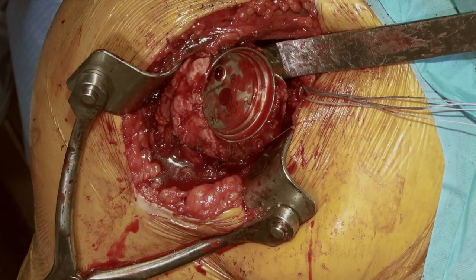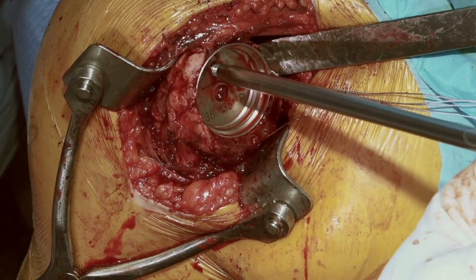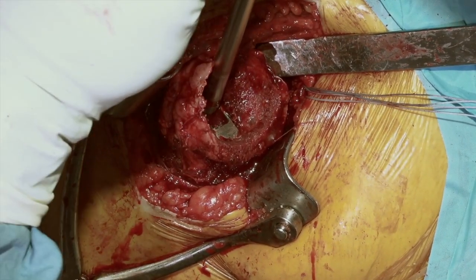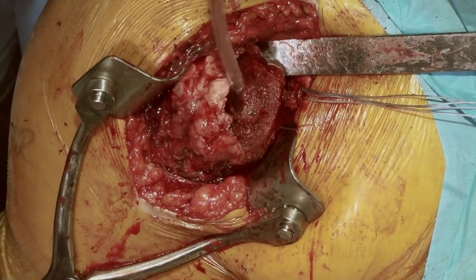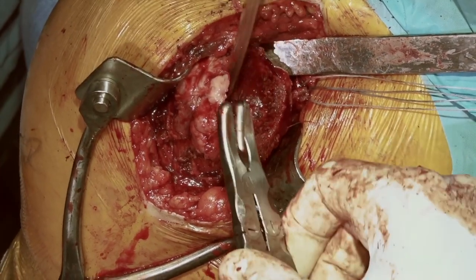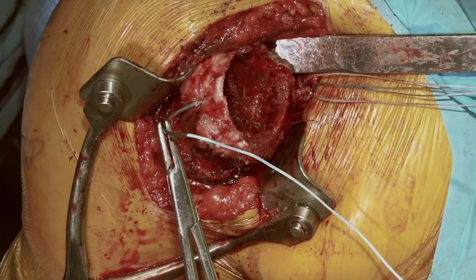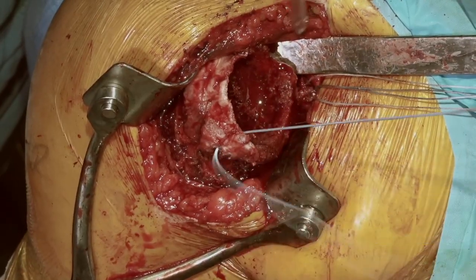We talked about the subscapularis earlier and we may not be able to repair it, but we do like to be in a position to repair it if we can. We'll put a few number 5 FiberWires in position to have the ability to repair our subscapularis if any of the fibers look worthwhile repairing and if it does not cause any contracture to the shoulder. We're removing the trial implants. Our subscapularis repair will be along the rim of the osteotomy. We know the upper tissue is not going to be very valuable, so we'll put it a little bit lower. We'll prepare the bone just a little bit on the lesser tuberosity and put in two or three number 2 FiberWire sutures to repair the subscapularis if possible.